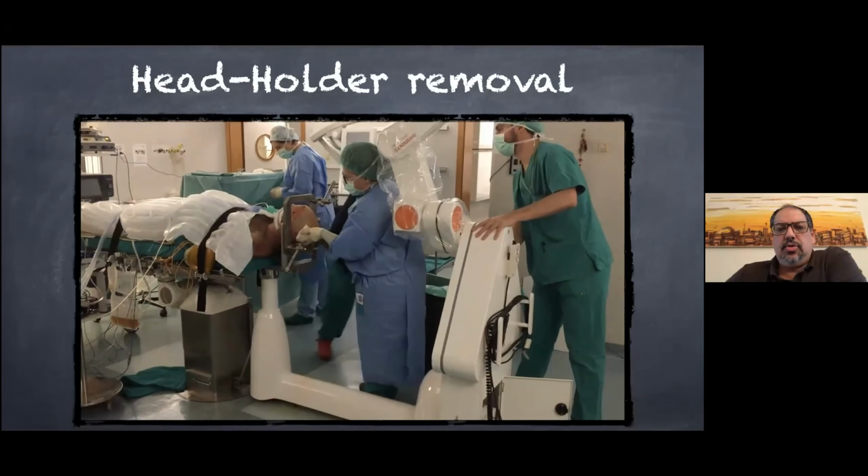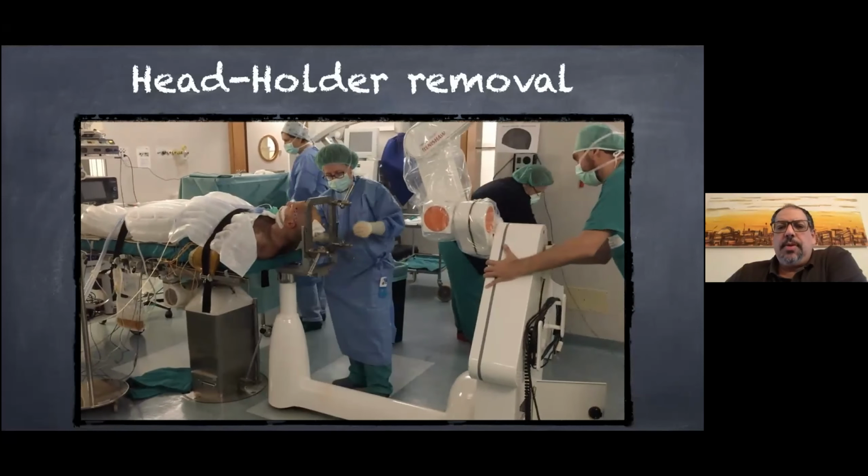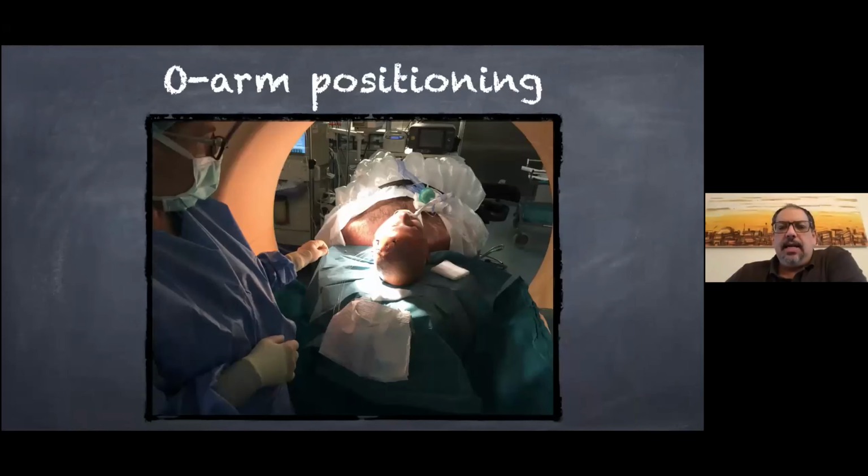Okay, so here you see the careful removal of the robot, and then we go on with implantation. So the arm here is again in position.